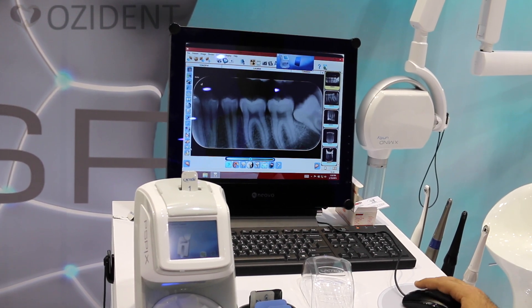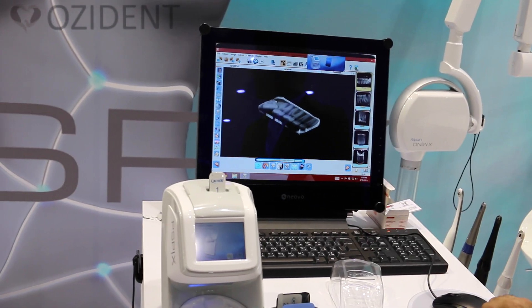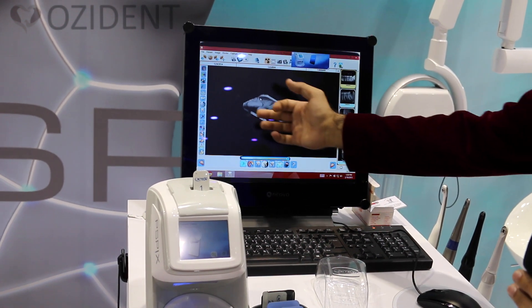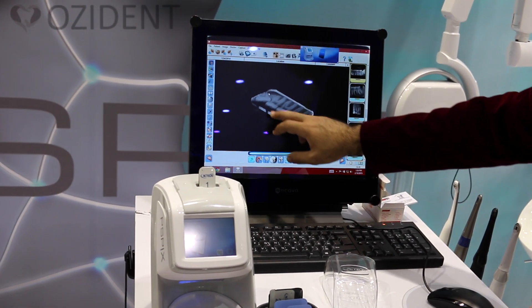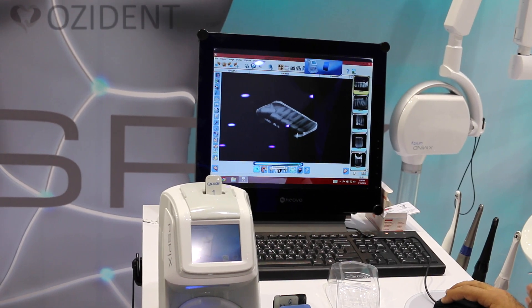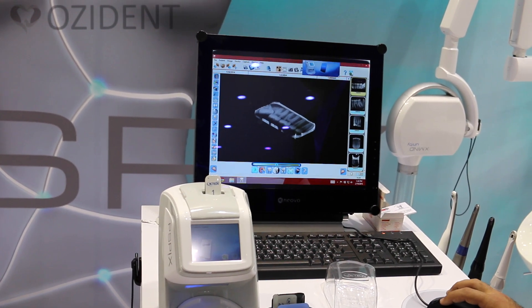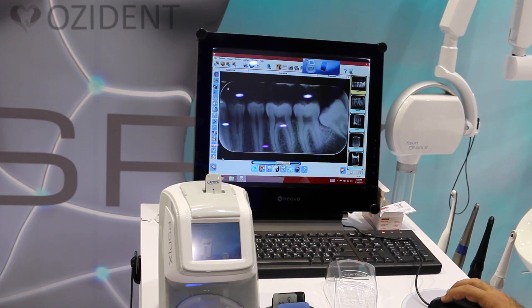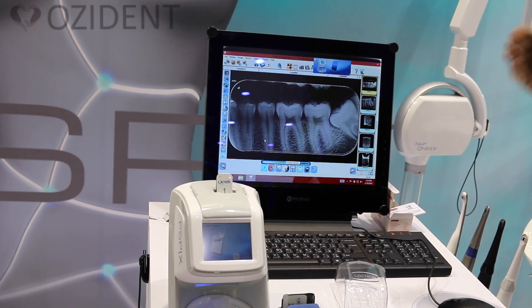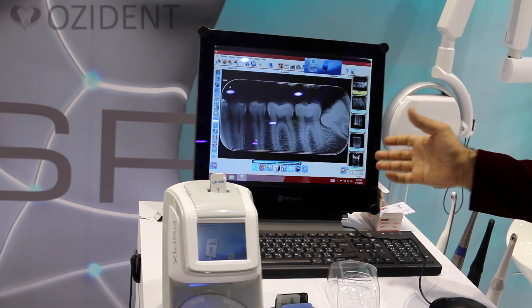Here is a nice option I like — it gives you a three-dimensional kind of image. Clicking on it shows a 2D image that uses exposure levels to simulate a 3D view, and you can have a layer-by-layer view. There is also the Relief option — the image is further emphasized so you can easily see which parts are in the front and which are in the back, giving you a better overall look at the image.